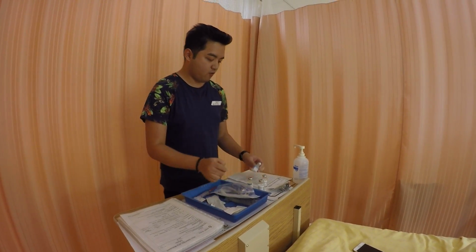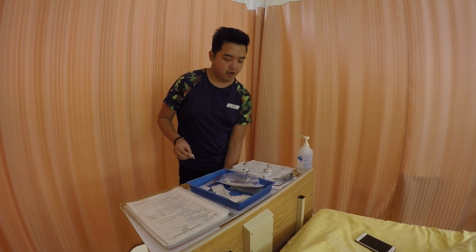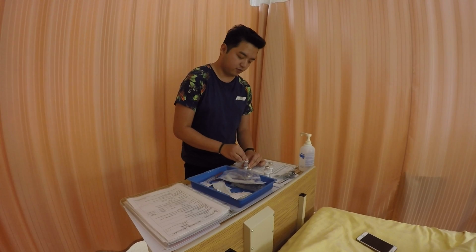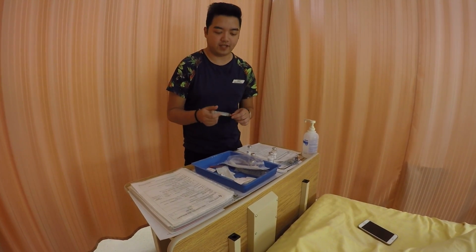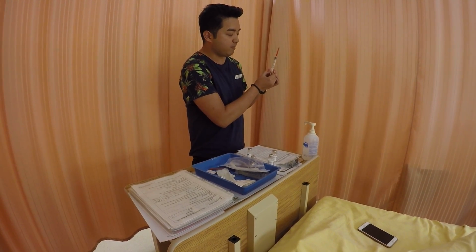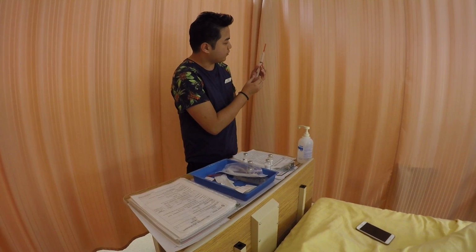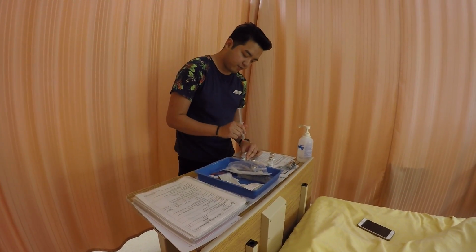Next, I need to alcohol swab my 10 ml sterile water to make sure that it's clean. Swab for 30 seconds and then let it dry for 15. Since we need 10 ml of water, we withdraw 10 ml of air into the syringe so that we can create some pressure inside.